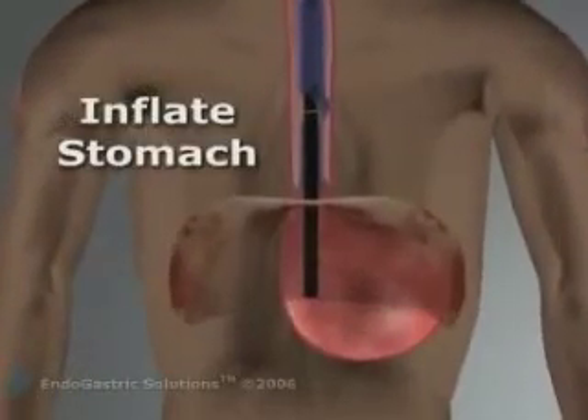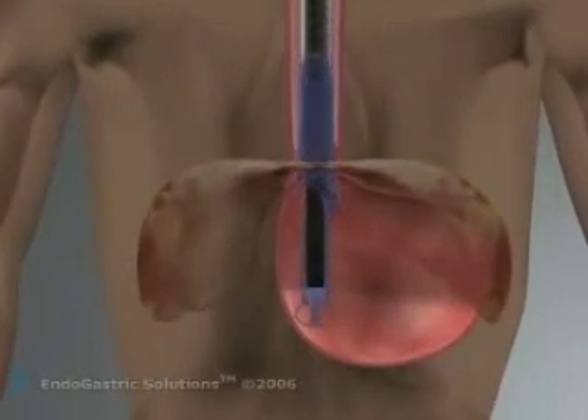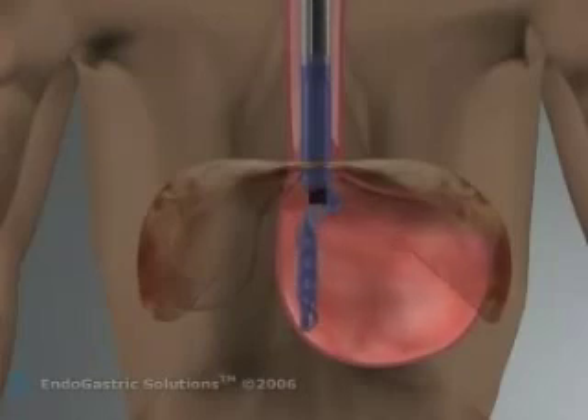The stomach is inflated and the endoscope is advanced and turned into a retroflex view so that it is looking up at the gastroesophageal junction. The mold of the device enters the stomach first and is positioned for surgery.